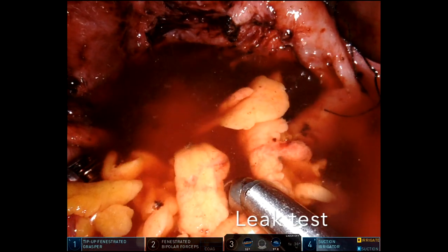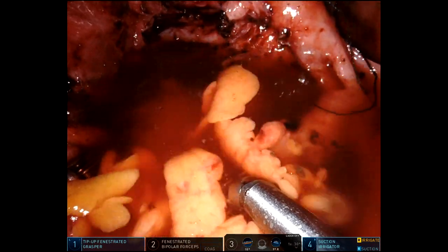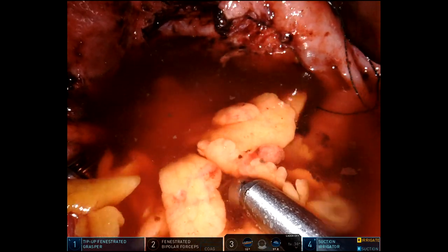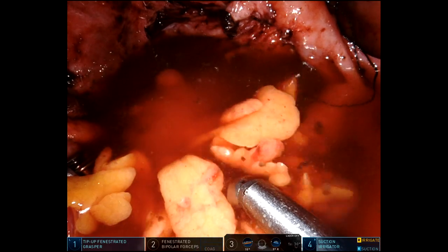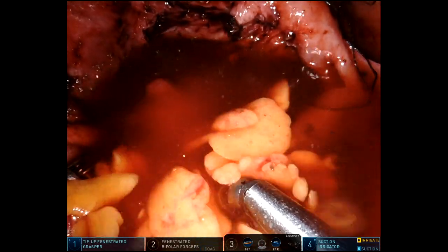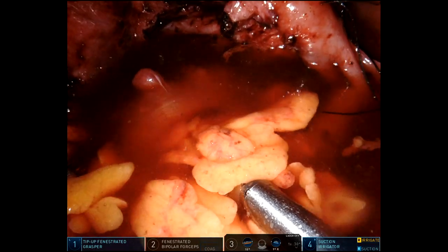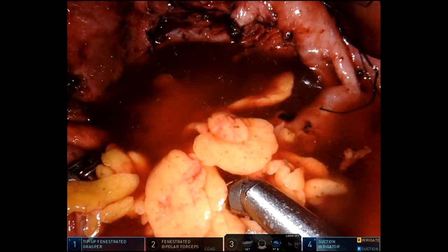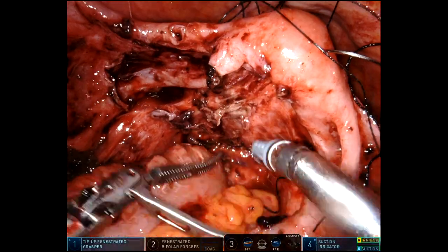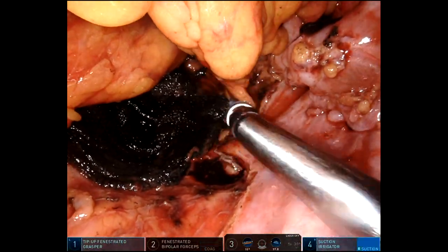The anastomosis is done and we'll do our leak test. I go up through the anastomosis with a 19mm proctoscope to confirm it's patent. I also did a vaginoscopy and didn't see any defects in the vagina. I felt I had really good distension with no bubbles, so I conclude the operation at this point. The patient did well and was discharged on post-operative day two.